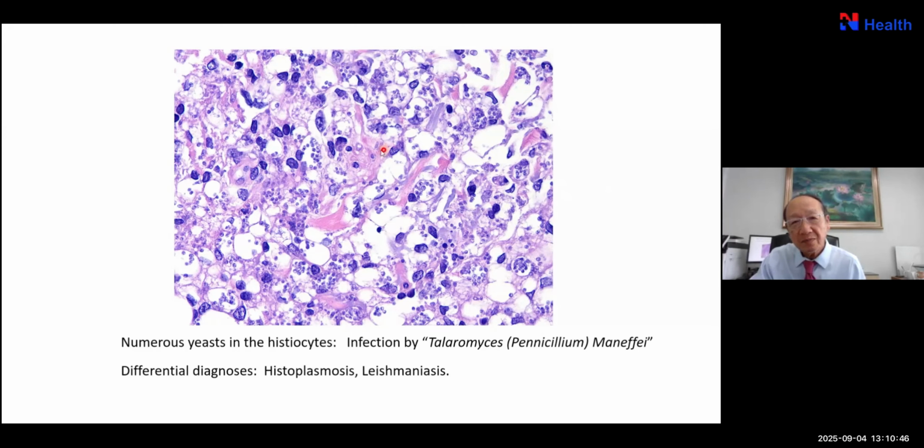Well, before the AIDS era, most pathologists will call this histoplasmosis because they look alike. But the microbiologist will call it back, that it's not histoplasmosis. We culture it, and it turned out to be Penicillium marneffei.